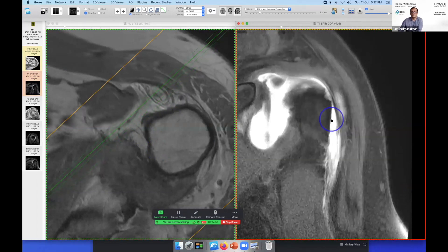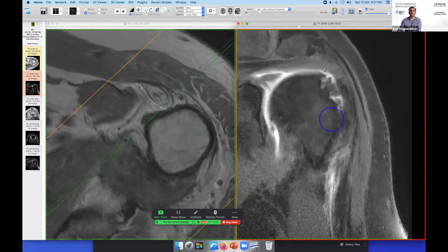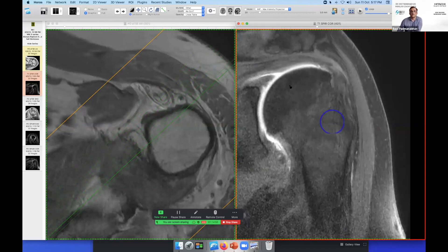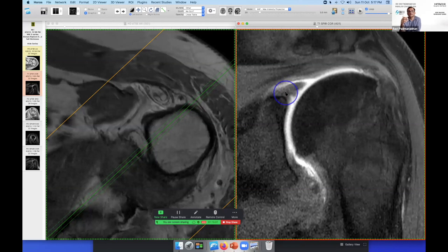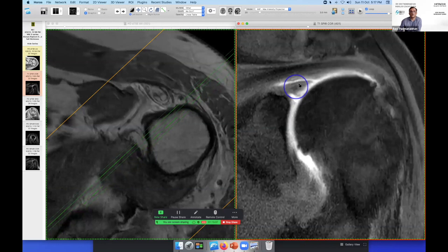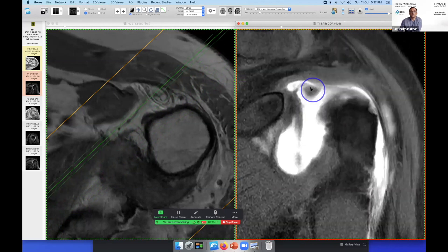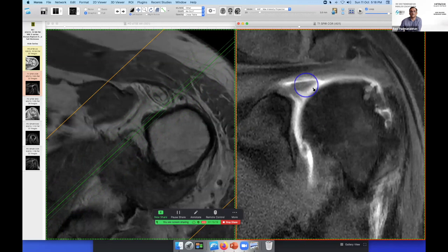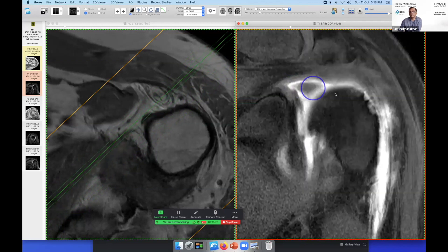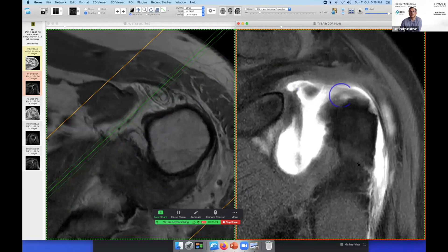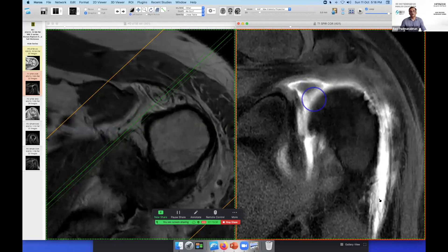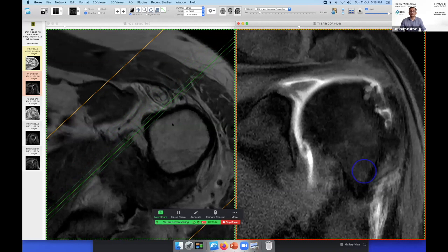If we're looking for the proximal portion, the best way to do that is to go to the coronal scans, find the superior labrum, and we know anatomically that the biceps tendon attaches to the superior labrum at the supraglenoid tubercle. So we follow it and see if we can find a stump. Here's something that looks like a biceps tendon, and then it just falls down and ends here — this is the stump of the biceps tendon. There's a big gap all the way down where it's ruptured and pulled back. Often you will be able to identify a residual tendon stump, but the distal portion is difficult to see as it's mostly out of our field of view.